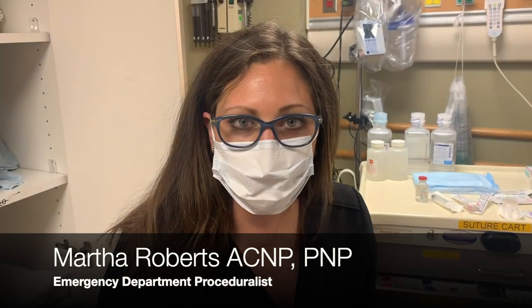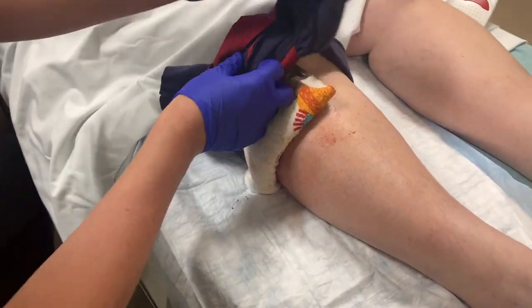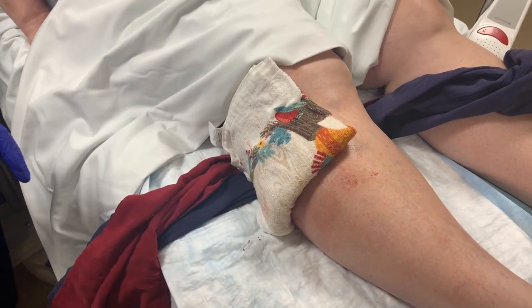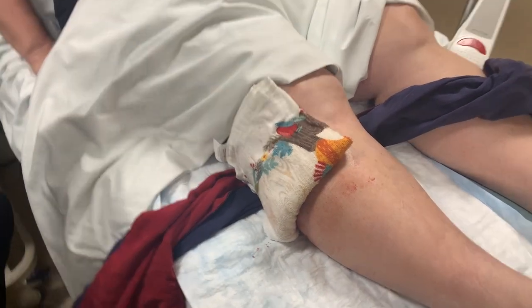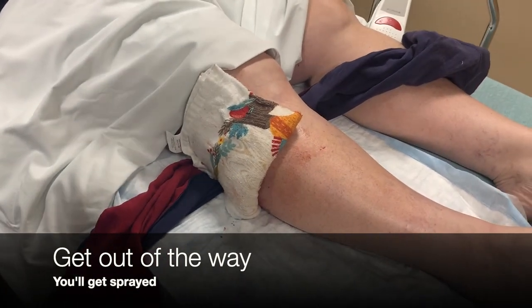I'm Martha Roberts and I'm going to be taking care of a varicose vein here. If you take a look, we've got some good compression here. Our patient nicked her leg and has a varicose vein.